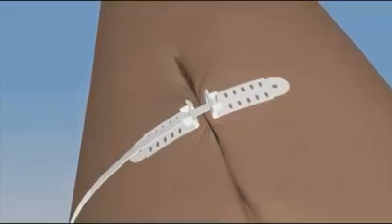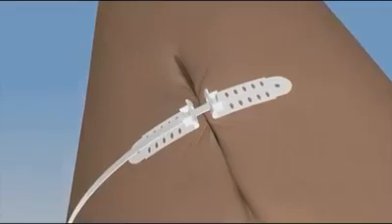After skin stretch is complete, the scar can be excised and closed without tension.